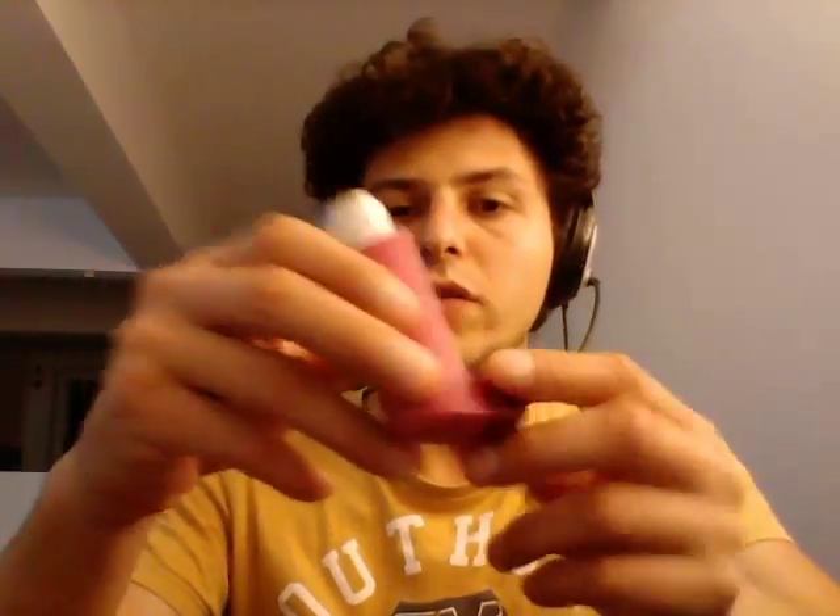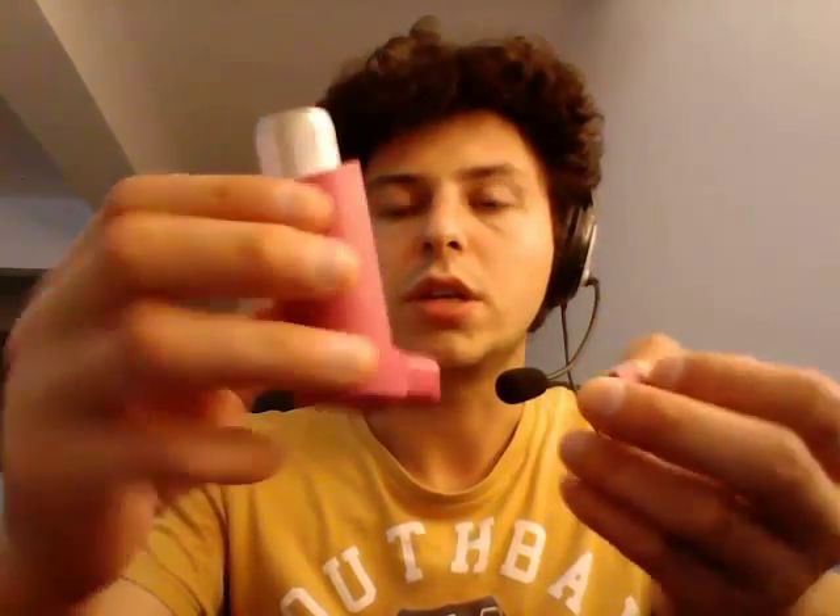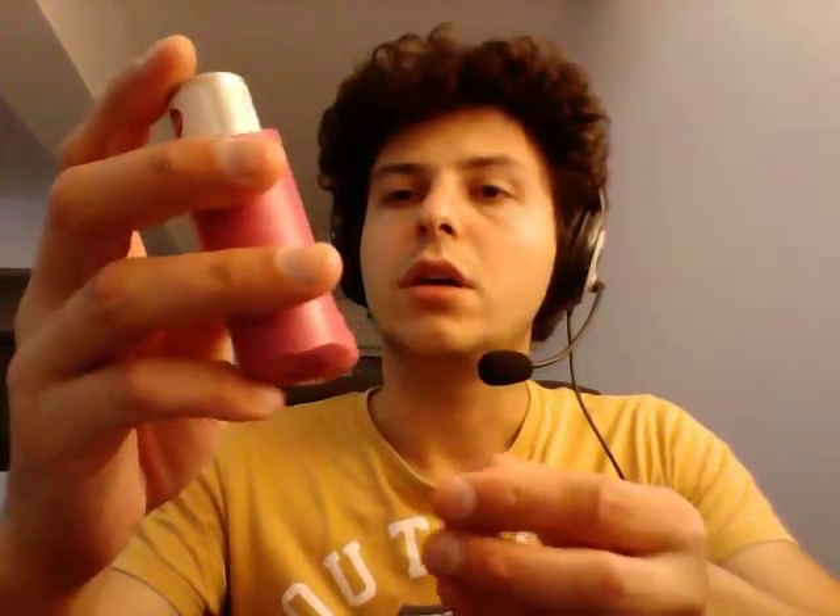This is a demonstrator device, but it's basically the same thing. Once you take out the cap, it's important you don't need to shake this. So with Foster, you don't need to do this, as you would with Ventolin. You just hold it steady, and it's important to breathe in slowly and to synchronize your breathing in with the actuation of the device.